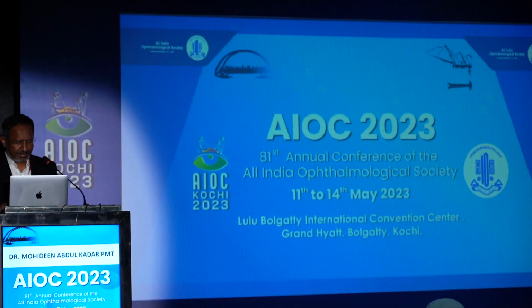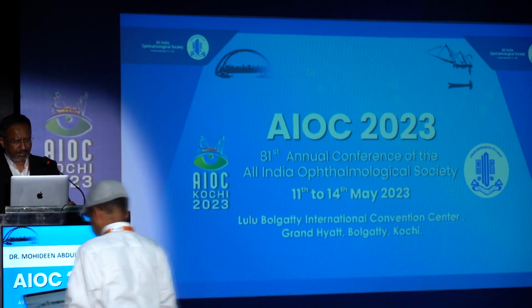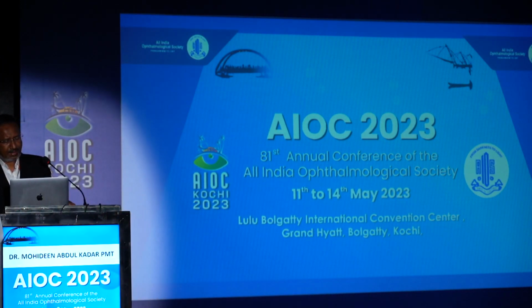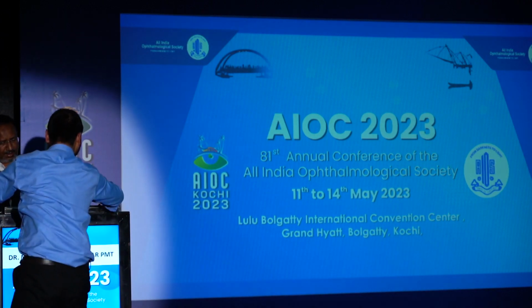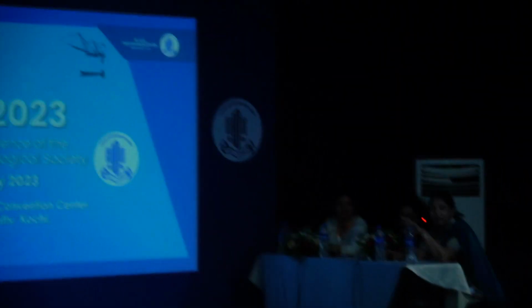Before we start, I would like to say that gonioscopy everyone has to do in all cases or suspect cases of shallow chamber and glaucoma cases above the age of 40. When you see any shallow chamber in the eye, it has to be done. It is a dynamic process. Every year it has to be repeated, or if any intervention is done, then also you have to do gonioscopy.